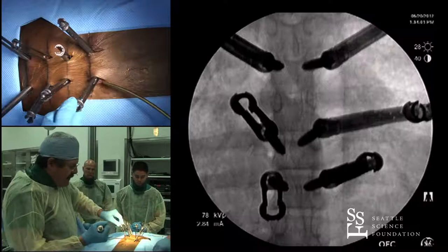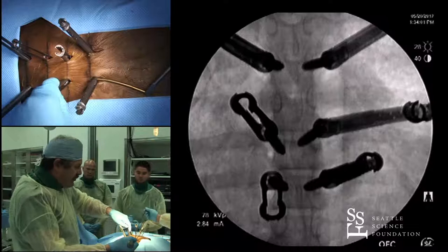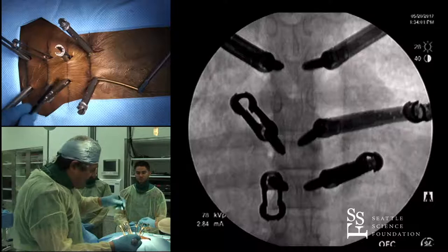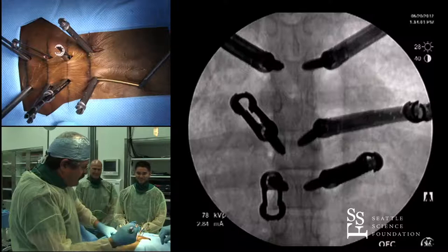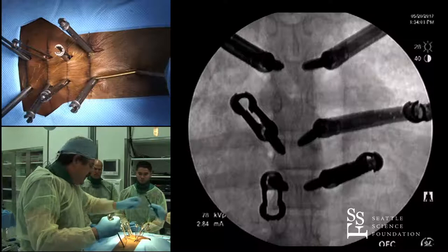In a thoracic spine I'll make the rod look a little short on the skin; in a lumbar spine I'll make it look a little long. I pass it through the same skin hole, and once I'm in my first hole I hold the second one and can feel my rod hitting the screw. Using my left hand on the screw and right hand on the rod, I get almost a triangulation — like arthroscopy — to get a sense of where the tip of the rod is. I can see my rod through the screw in this thin cadaver; in a larger patient you can't do that.